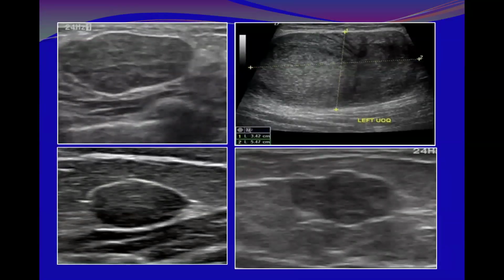Okay, these are examples of oval parallel masses surrounded by pseudocapsules. I have to make sure here the image is not complete. I should not pass it like that. I have to look in real time to make sure the pseudocapsule is intact in the lateral aspects. And again, for this, I have to make sure, yes, it is intact throughout, but I should not pass it. I have to make sure both lateral aspects are okay.